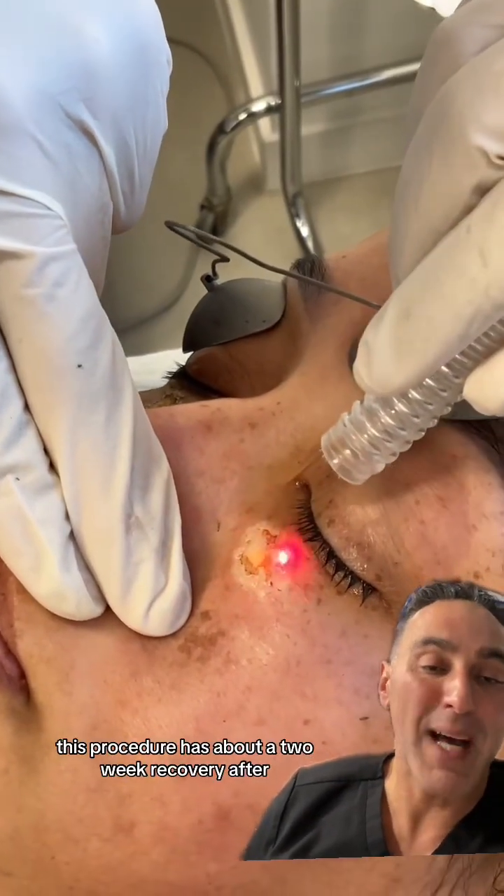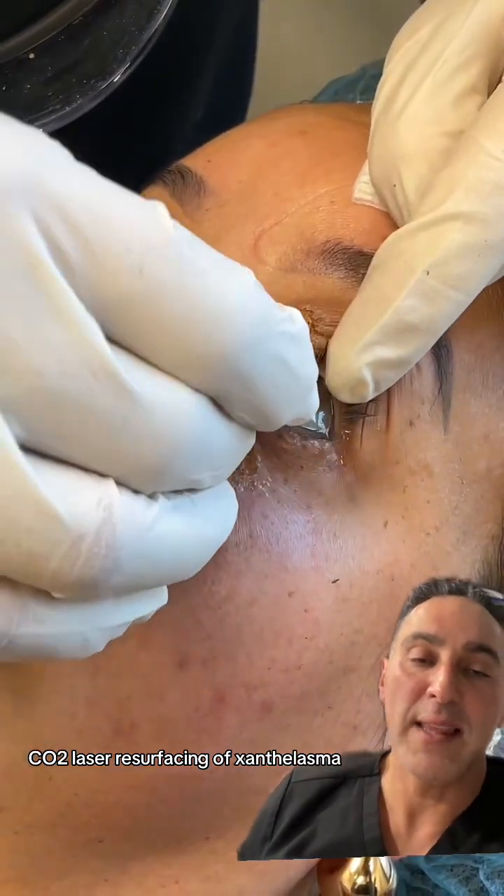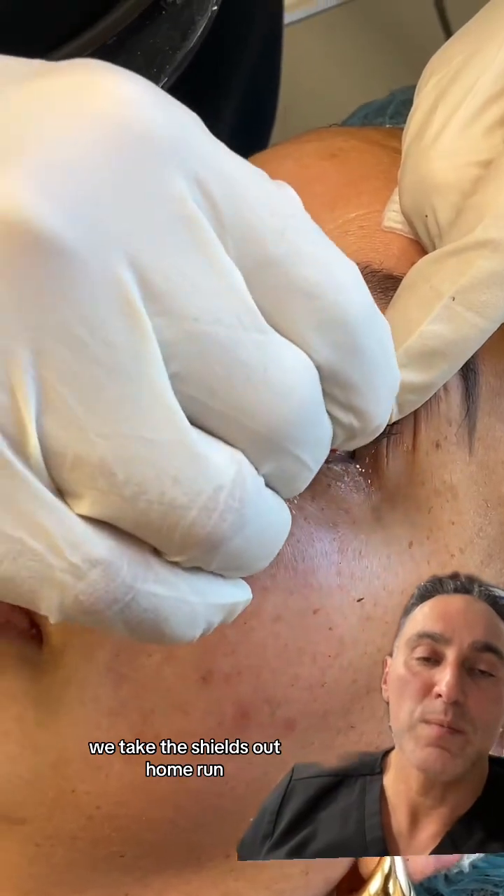This procedure has about a two-week recovery after CO2 laser resurfacing of xanthalasma. We take the shields out. Home run.